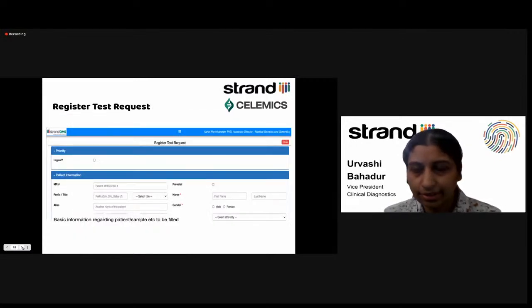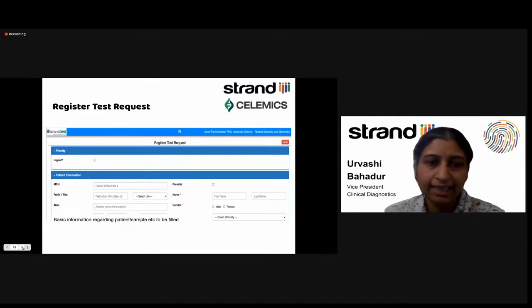So this is just a quick screenshot of some of the fields, and there are many more fields that may or may not be entered, depending. A few of them are of course essential, and then the rest you can add if need be, if that's what you need.